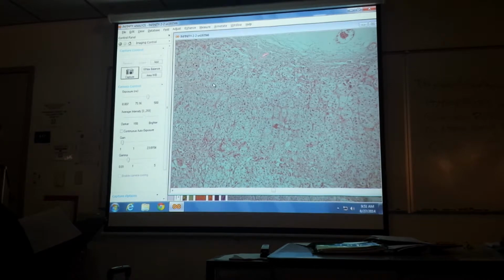So how I orient myself is, okay, there's my white space, so I know that's the capsule. See these clumps of cells that are kind of ovally looking? If it's the outermost zone, which one is it? Aldosterone. Glomerulosa. Now, to orient yourself, this is the medulla down here.